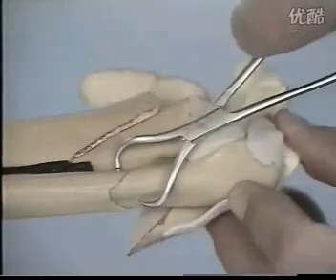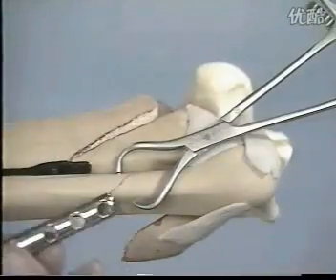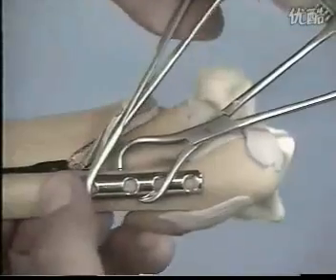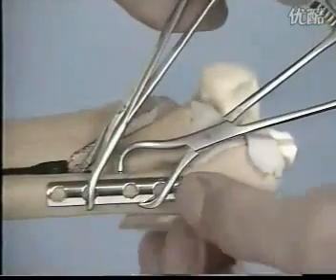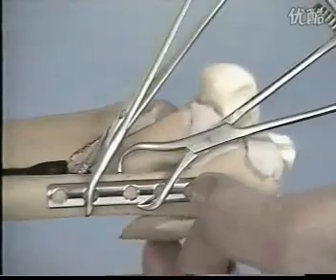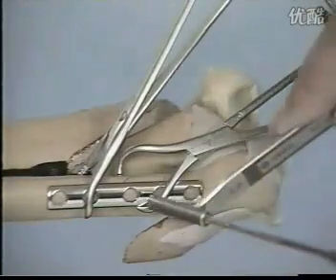In the first step, the oblique fibular fracture is reduced and stabilized. After reduction, we place a 5-hole 1/3 tubular plate to the lateral plane of the fibula and drive a lag screw through the center hole.